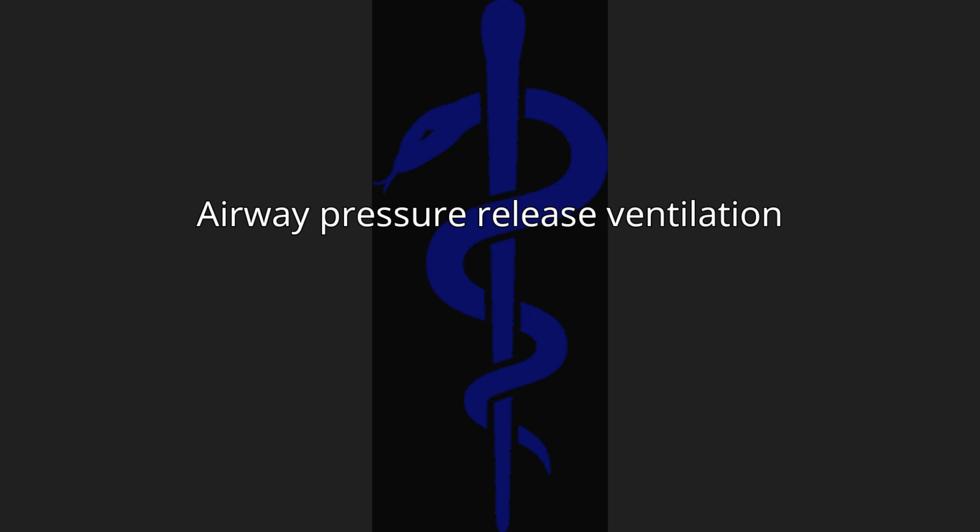Airway pressure release ventilation. Airway pressure release ventilation is a time-cycled alternation between two levels of positive airway pressure, with the main time on the high level and a brief expiratory release to facilitate ventilation. APRV is usually utilized as a type of inverse ratio ventilation. The exhalation time, TLO, is shortened to usually less than 1 second to maintain alveoli inflation. In the basic sense, this is a continuous pressure with a brief release.